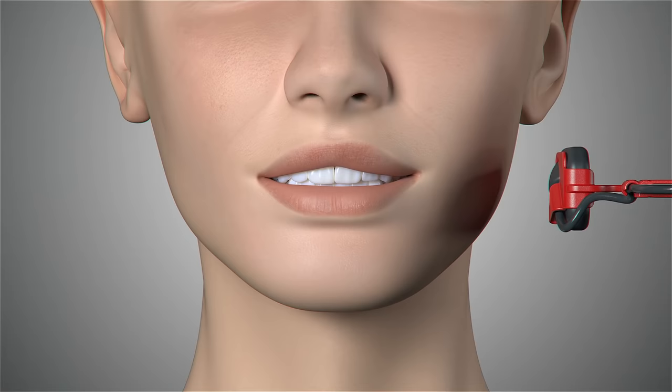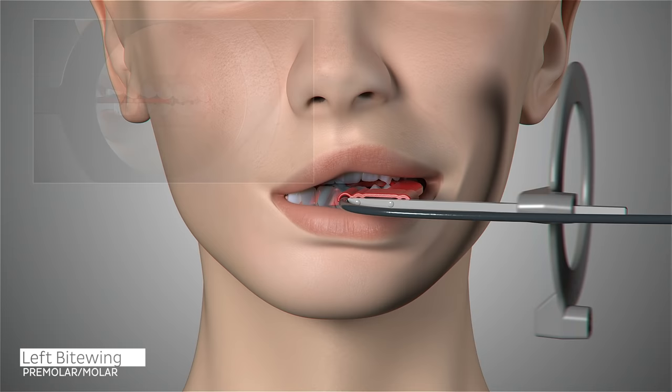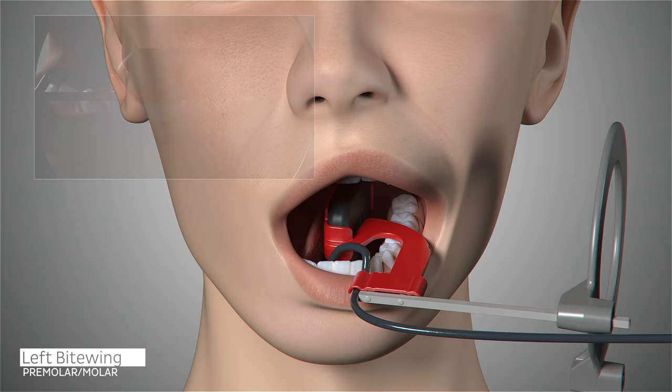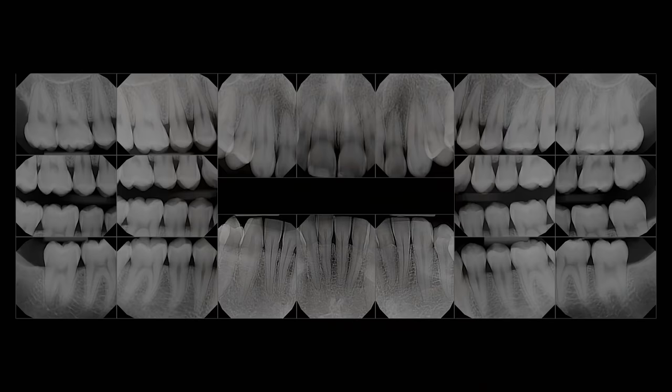The configuration of the sensor and holder does not have to change for the next and final set of images, the left bite wings. Ask the patient to open slightly and center the first and second premolars on the sensor in order to capture the distal of the canine. Ask the patient to close. Slide the aiming ring close to the patient's face, position the x-ray emitter cone flush with the aiming ring and trigger your exposure. Position the sensor so that it is parallel to the occlusal line, center the sensor on the second molar and ask the patient to close. Slide the aiming ring close to the patient's face, position the x-ray emitter cone flush with the aiming ring and trigger your exposure.